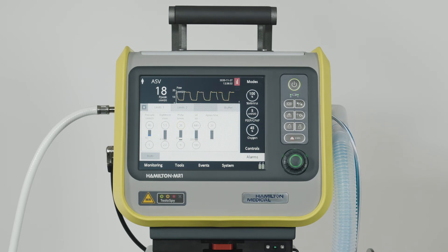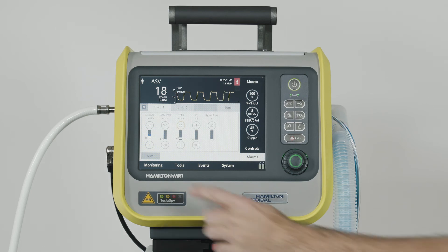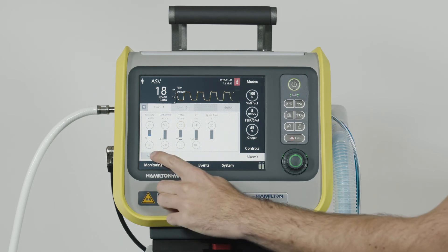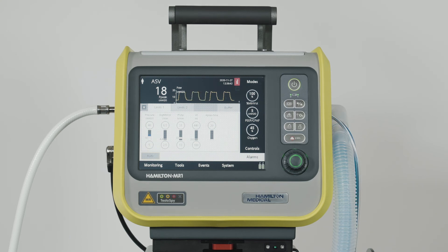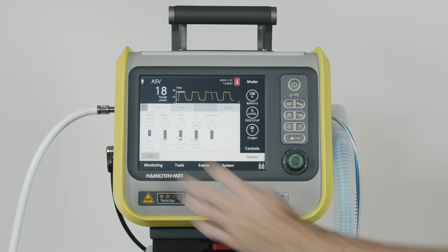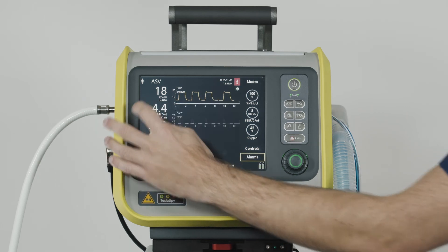To set alarm limits quickly, you can touch the Auto button. All the alarm limits, except for tidal volume and apnea, will automatically be set around the current monitoring parameter values.